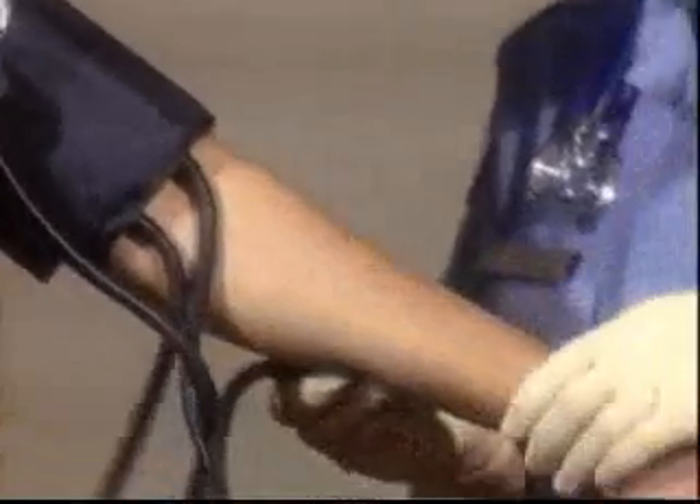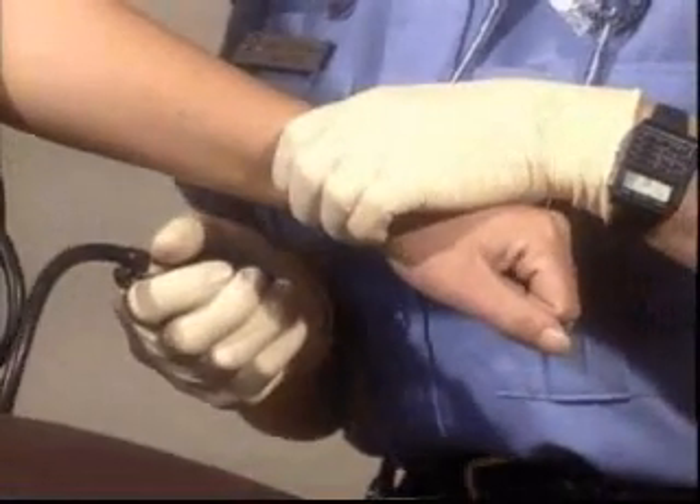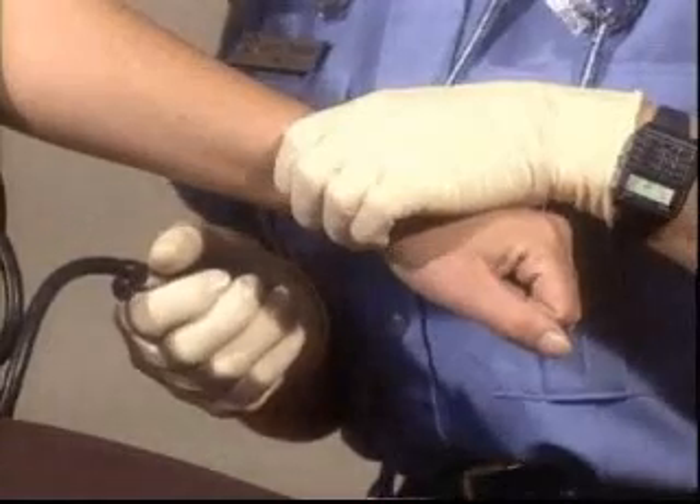Next, with your first two fingers, feel or palpate for a pulse on the radial artery. The radial pulse is found on the thumb side of the forearm at the wrist.